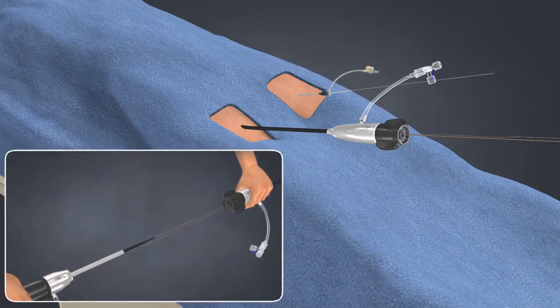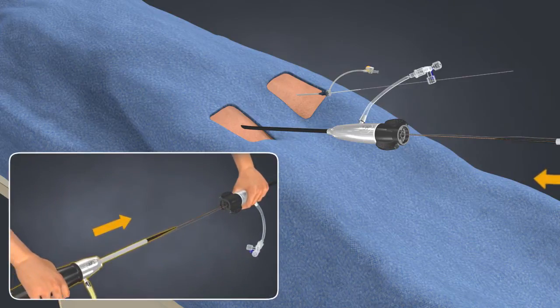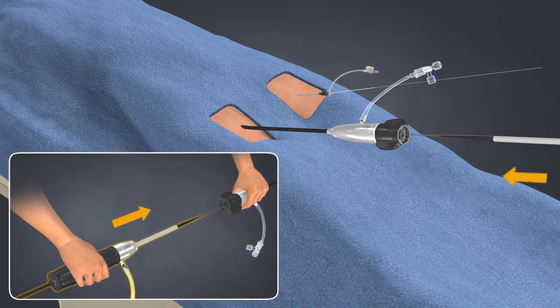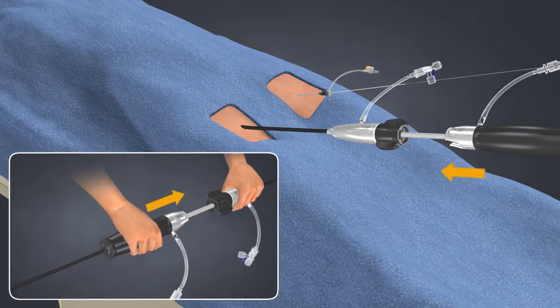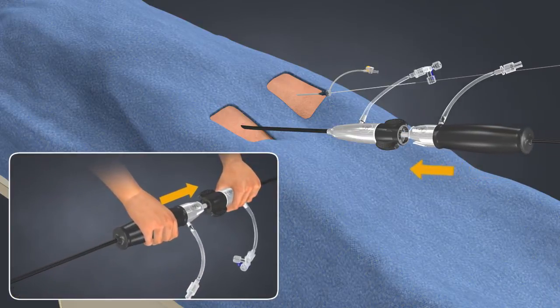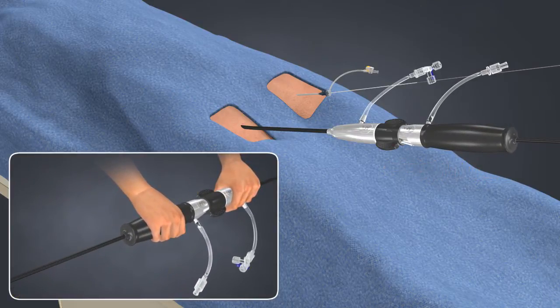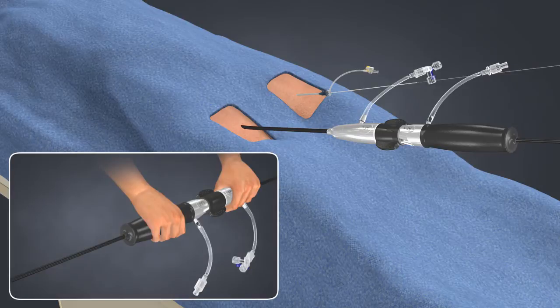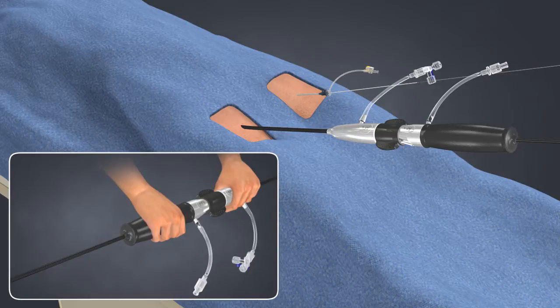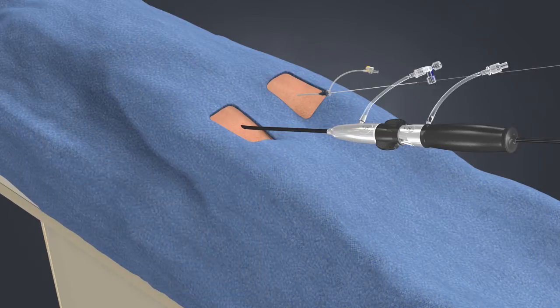Keeping the flush port medial, advance the bifurcated delivery system over the 035 guidewire until you hear it click. This transforms the introducer and the bifurcated delivery system into a single unit.